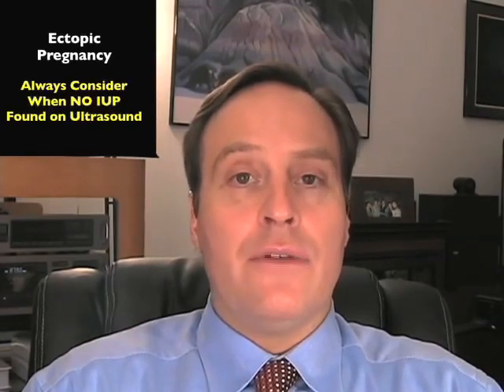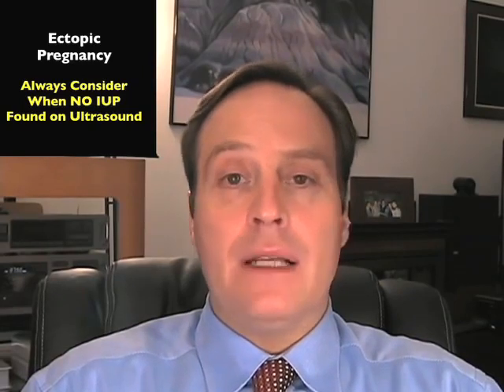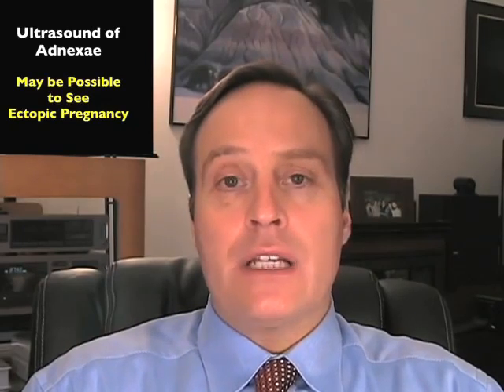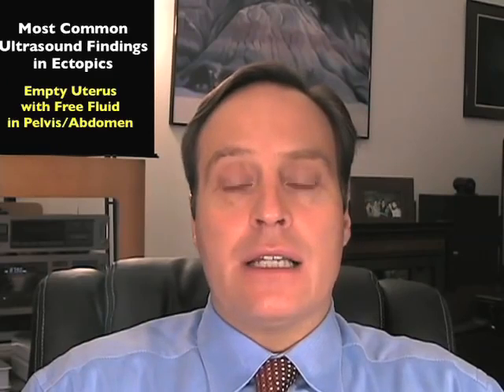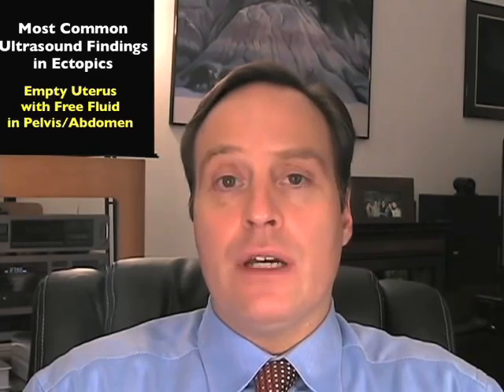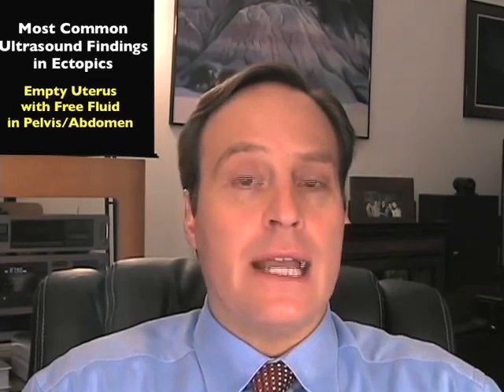So now that we've discussed some important facts and figures about ectopic pregnancy, let's describe what we're actually looking for on the transvaginal sonogram. We must consider ectopic pregnancy, as we talked about earlier, when we fail to see an intrauterine pregnancy with a relatively elevated beta-HCG. Now, if we look at the adnexa, we may be lucky enough to actually see the ectopic pregnancy as visualized by a yolk sac or fetal pole within the tubal ring. But many times we're not going to see this, and we're going to see findings that are suggestive of ectopic pregnancy, such as free fluid within the pelvic cul-de-sac or within the abdomen.